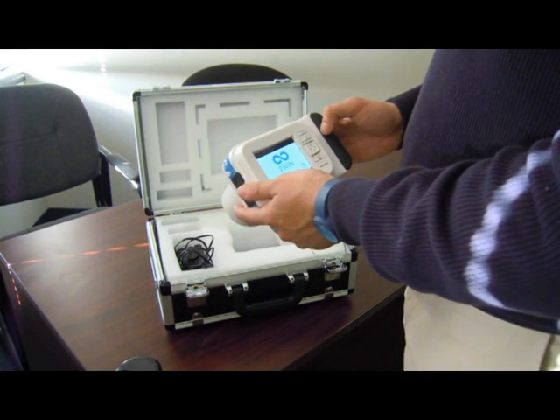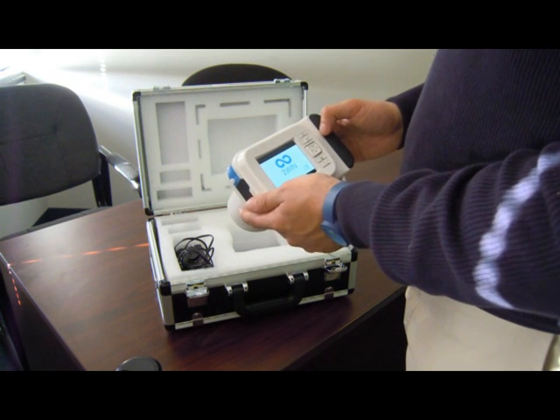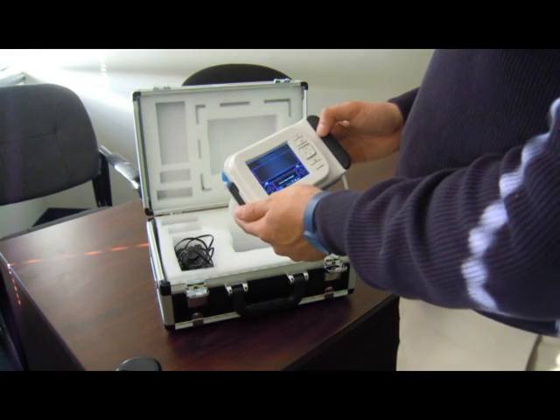All you need to do is follow some simple instructions. Turn the 2-WIN on by pressing and holding the on-off button for one second, and wait until the standby screen appears.